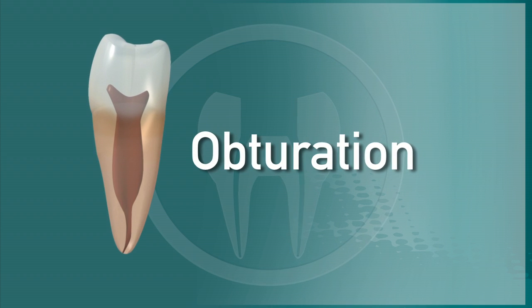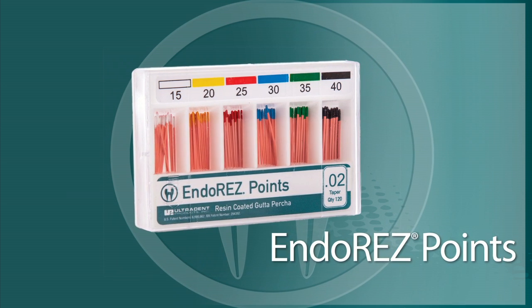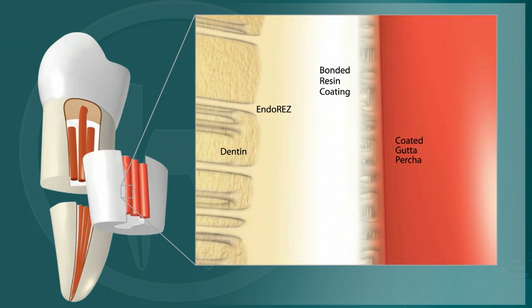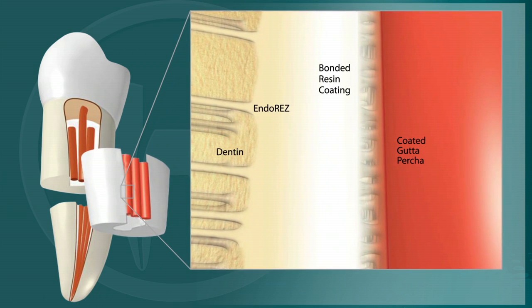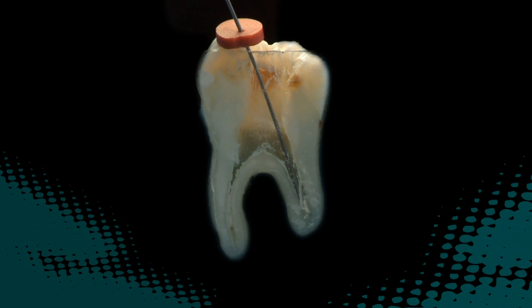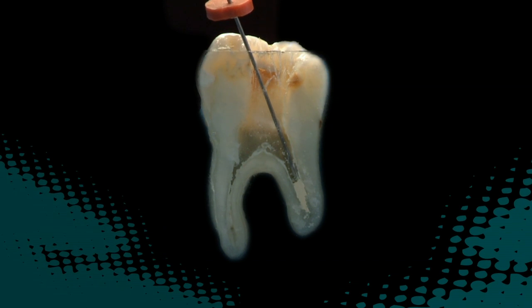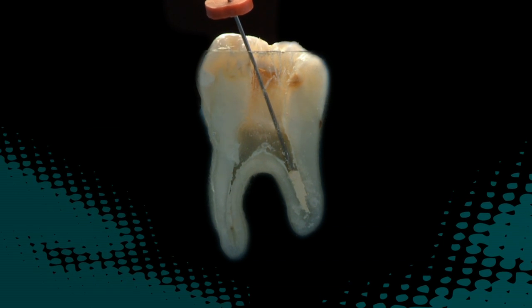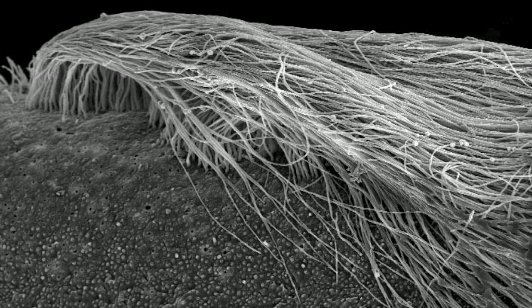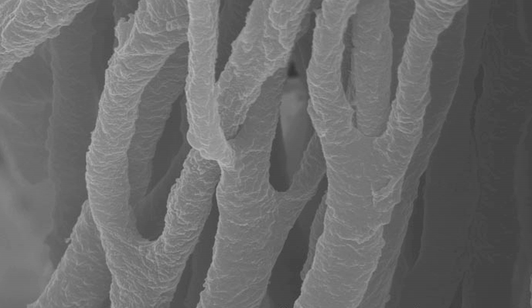We are now ready to move on to the obturation portion of the procedure. The EndoRes system includes EndoRes points, which are gutta percha points with a unique resin coating that allows the gutta percha to bond covalently to the EndoRes sealer. EndoRes is ideally delivered apically via a 29-gauge Navi tip, eliminating gaps and voids. No pressure or heat is required. The sealer's hydrophilic feature allows it to follow residual moisture deep into the dentinal tubules and readily flow into intricate canal spaces and auxiliary canals.